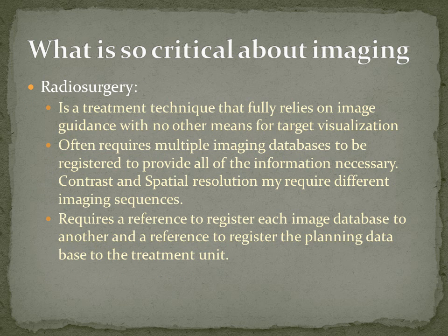So what's so critical about imaging? Radiosurgery is a treatment technique that fully relies on image guidance. There is no supplemental systems, and I'll explain what I mean by that in a moment. Often requires multiple imaging databases. Today, we're doing 5 radiosurgery cases, and 4 of them will have MR CT fusions, and the 5th one will have a CT angiography procedure.